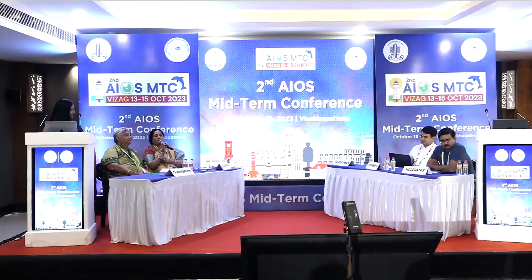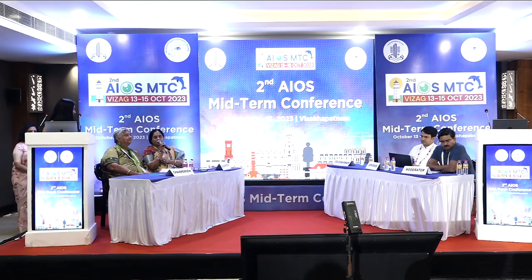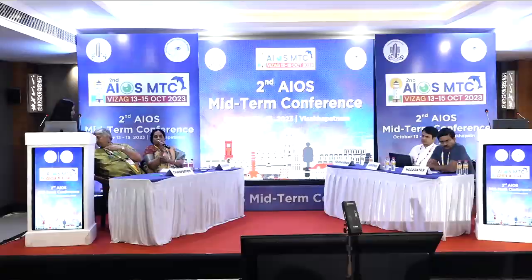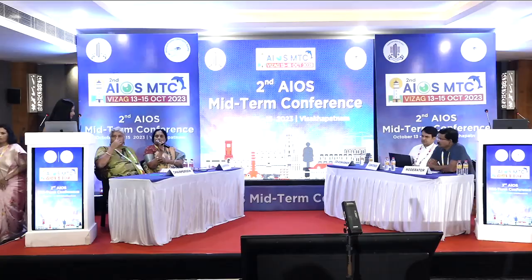So definitely MRI and CT both have their roles in the orbit, and though MRI has come in, you cannot say that CT is totally ruled out in orbital cases, because you sometimes do need information about the bony orbit as well, to plan your surgeries, and in thyroid disease to decide whether it's a tight orbit, a small orbit.